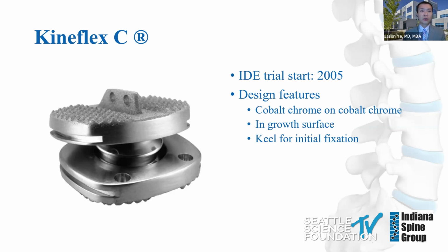In 2018, Dr. Cork and members of the group in the initial IDE trial published their 5-year results. They report generally favorable clinical outcome measures. The mean serum cobalt level was 0.2 micrograms per liter, and mean serum chromium levels were 0.3 micrograms per liter. In surveillance for a metal-on-metal hip, the recommended level for removal of such a hip is often 10 times that amount, so 2 micrograms per liter as opposed to 0.2.